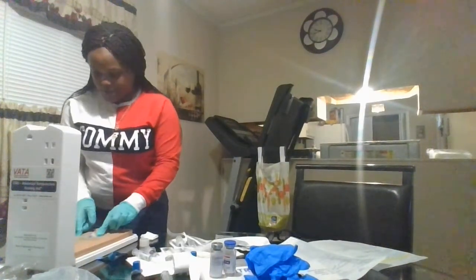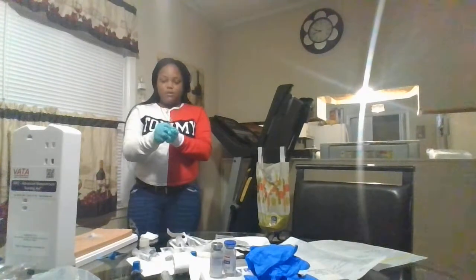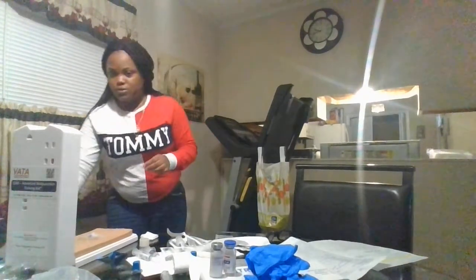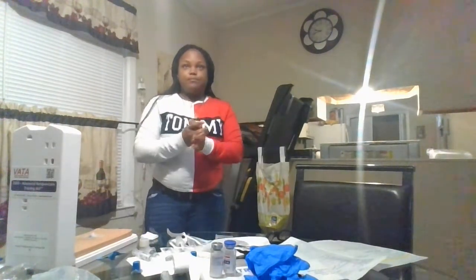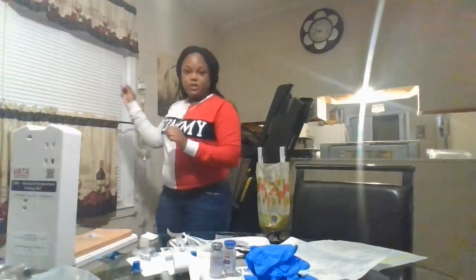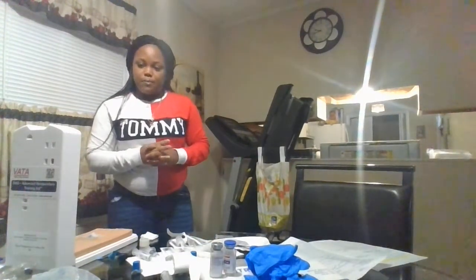All right, everything's good. Mr. Jack, you now have your IV in. I'm going to remove my sterile gloves, remove my goggles, and wash my hands. I'm going to take this with me to the door, to the sharps. All right, I'll be right back with your meds and my supplies.